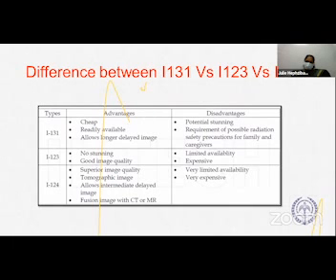It has good image quality. It's a pure gamma emitter. But the disadvantage is that it's limited availability and it's expensive. It's a cyclotron produced radioisotope. Iodine 124 is a PET emitter and has superior image quality. We can have fused image with CT or MR, but very limited availability and extremely expensive, not available in our country. So for all practical purposes, we use iodine 131.